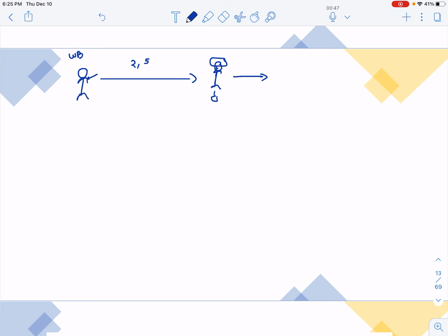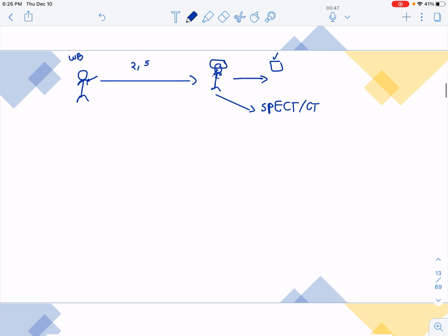If the picture that we got is normal or abnormal, but we don't need extra pictures, we don't need SPECT, we can say to the patient, you can leave, and we got all the information that we want. If the picture shows a lesion that we cannot detect, the radiologist may ask for more pictures, like SPECT, CT, or even statics.